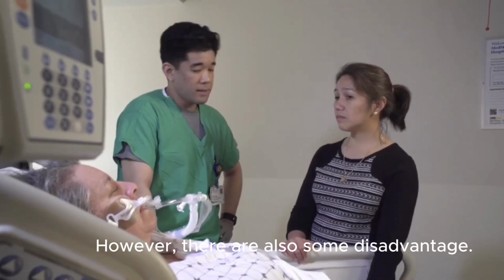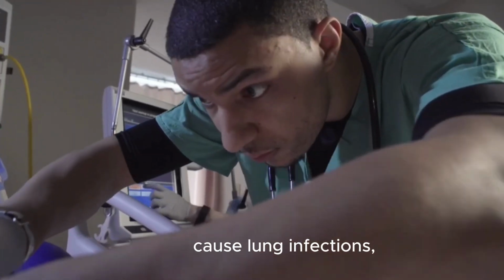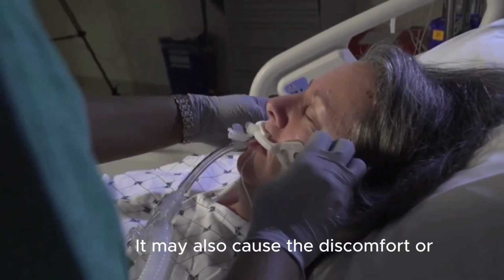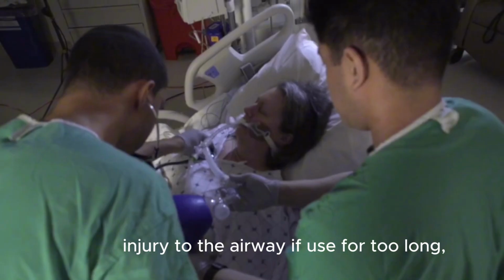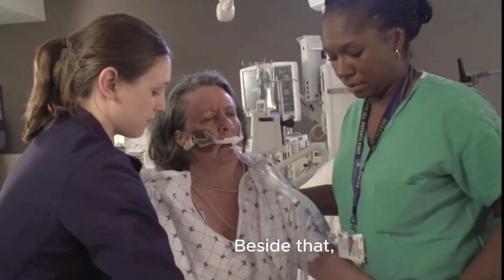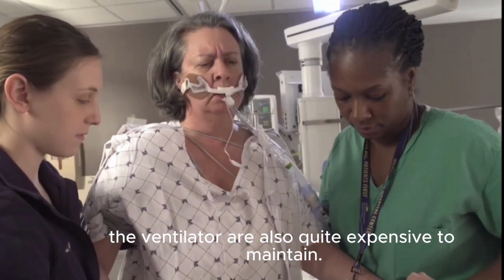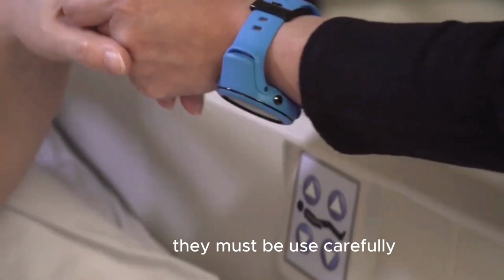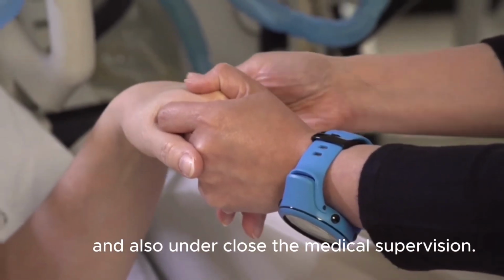However, there are also some disadvantages. Long-term use of a ventilator can cause lung infection such as ventilator-associated pneumonia. It may also cause discomfort or injury to the airway. If used for too long, patients can become dependent on the machine. Besides that, the ventilator is also quite expensive to maintain. So, while ventilators are very helpful, they must be used carefully and under close medical supervision.